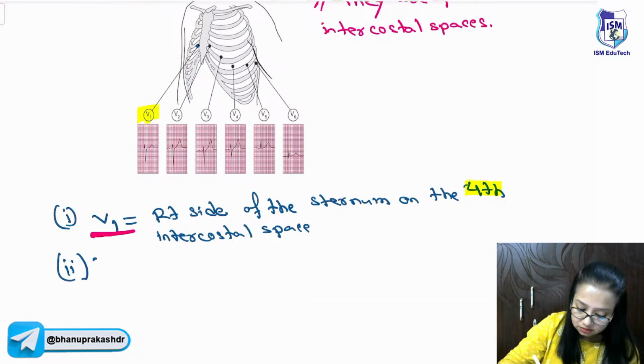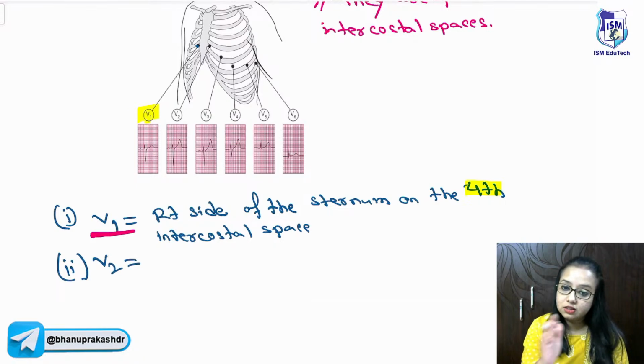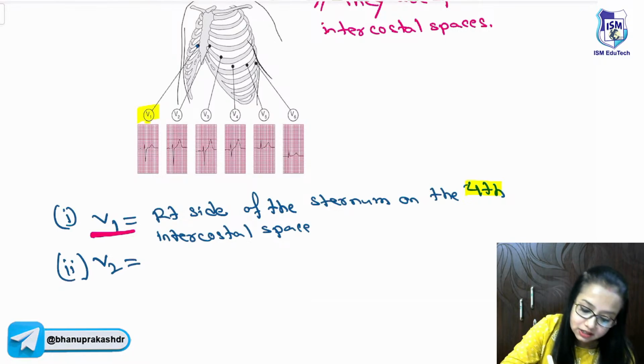Second one, V2. V2, if you see, it is lying on the same location as the V1. The only thing is that it is on the left side.